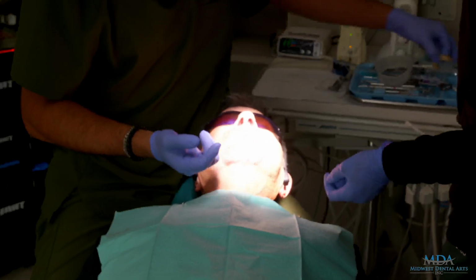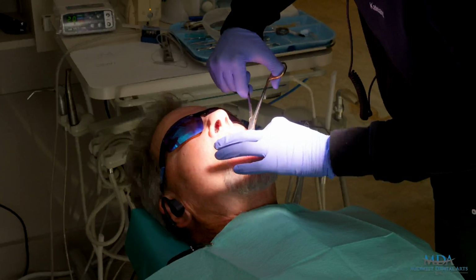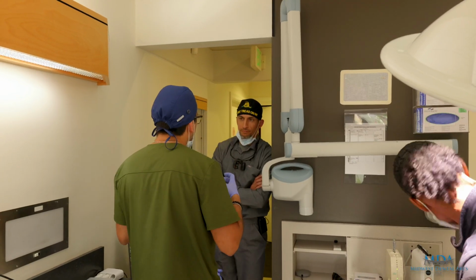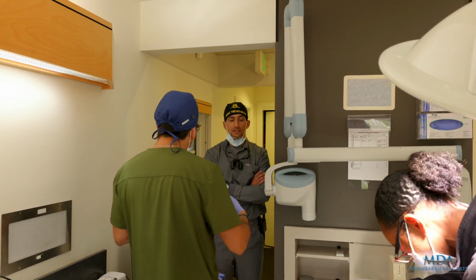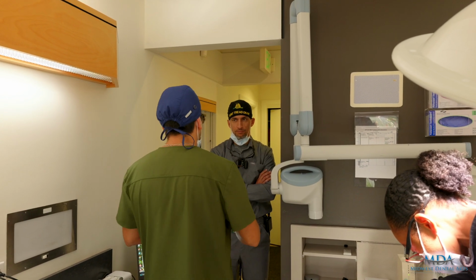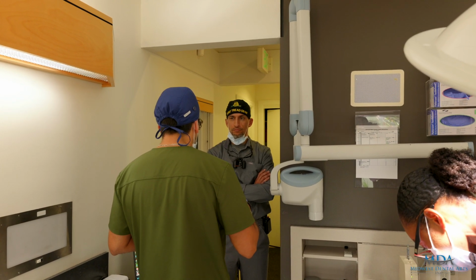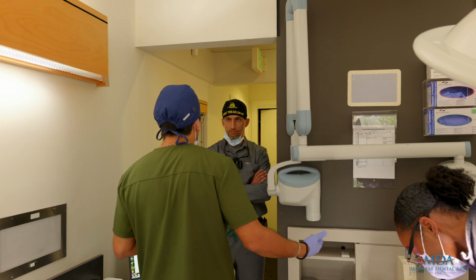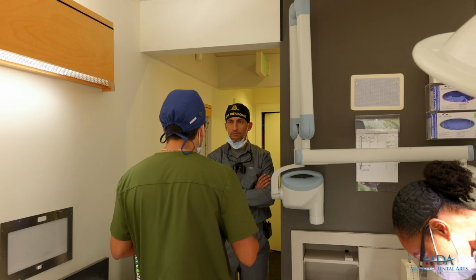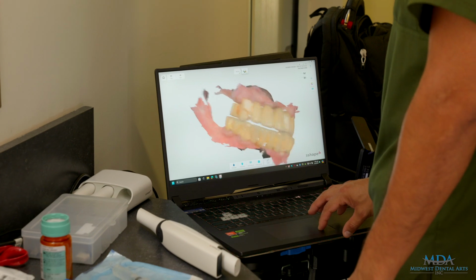I like to think of it as a new starting point. The idea for him to leave home today was something that's big that he can eat. He can bite something good, nice and tight, and doesn't move, and it also fits as well as we can because we'll install it today. You'll adjust it and you'll make it fit perfect. Then we need to still do the final design for a final zirconia. He can wear this maybe for 2 weeks. He can come back. You can see how he is. Maybe a new bite adjustment. See how he feels. And if you're ready to go to final, we can go to final.